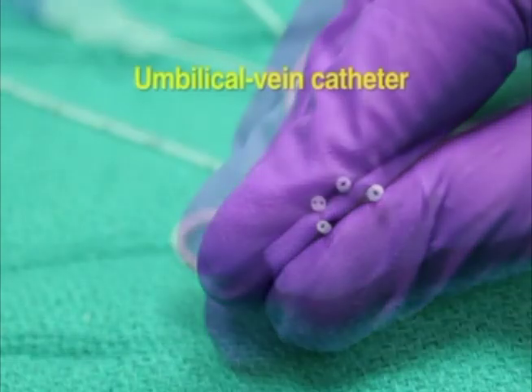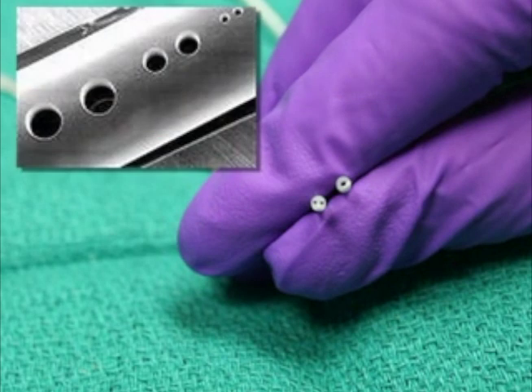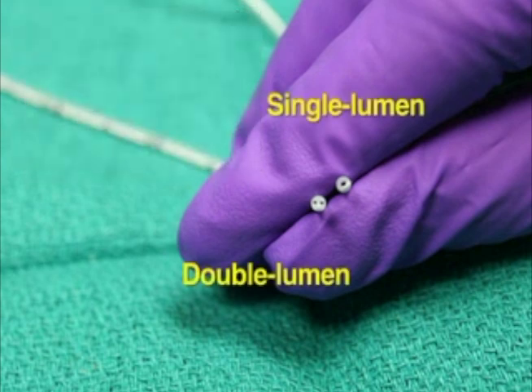The umbilical vein catheter should be 5 French for infants weighing less than 3.5 kilograms and 8 French for infants weighing more than 3.5 kilograms. Consider using a venous catheter with side holes when the catheter will be used for exchange transfusion. Otherwise, venous catheters can be single or double lumen and should have one hole.